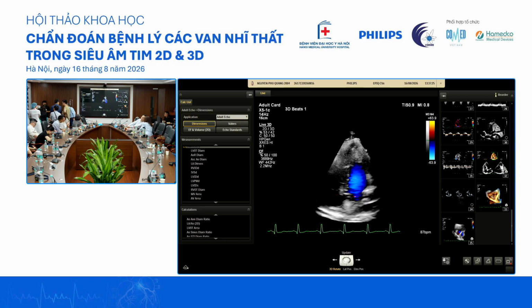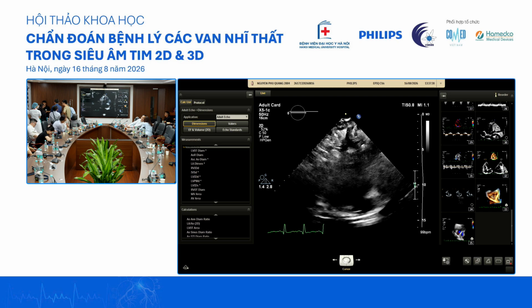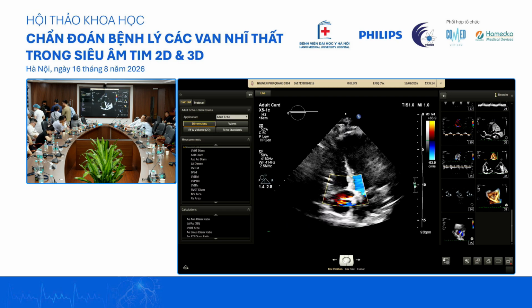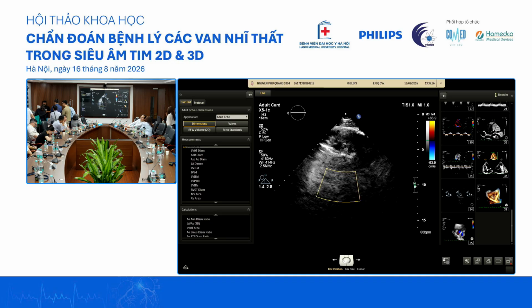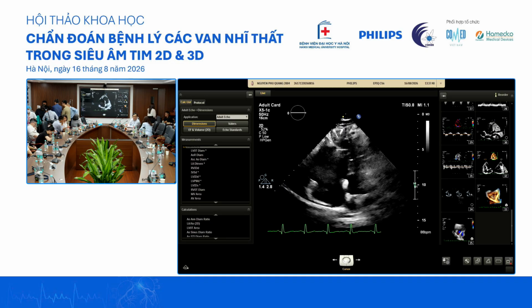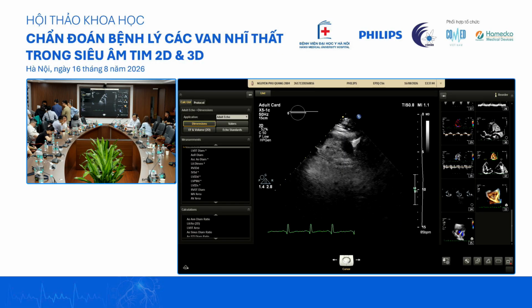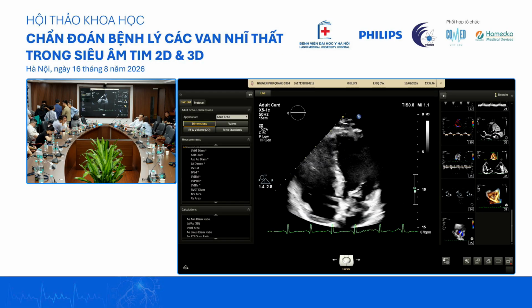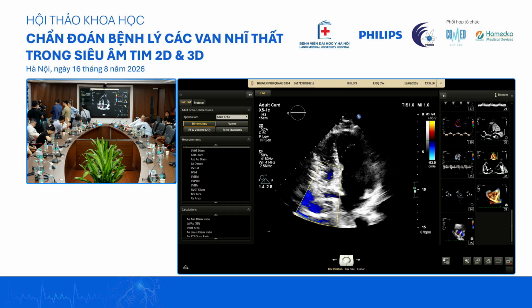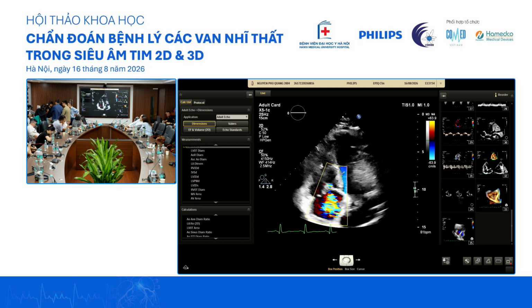It's not on the RV focus. His TR is not covered. Got to find the TR first, then we turn on the live 3D. It's better on the more front view. Okay, good.